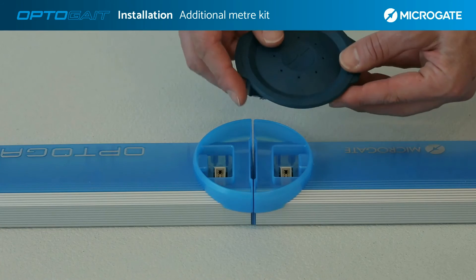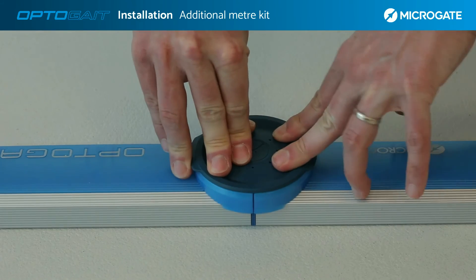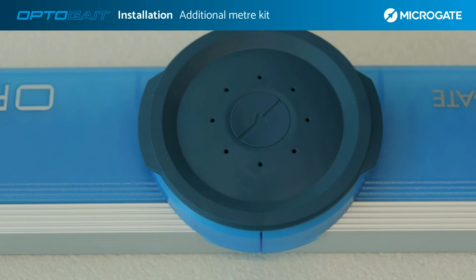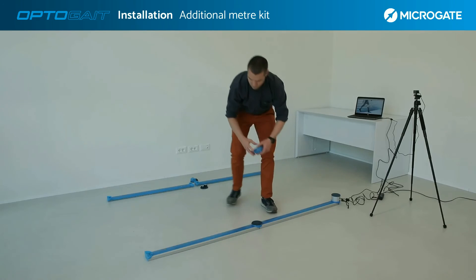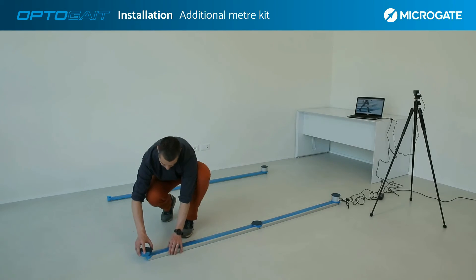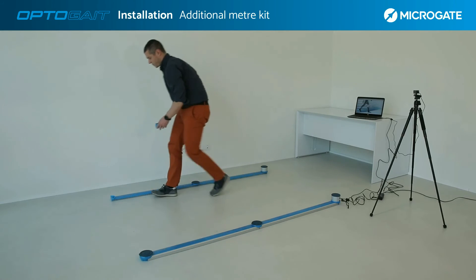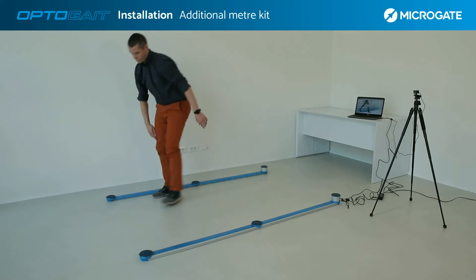Use the dedicated connectors to join the bars. Pay particular attention to the direction of the logo, characterized by an arrow that must be placed in the opposite direction to the LEDs. With these simple steps it is possible to install an additional meter, or dozens of meters, in just a few minutes. After the end caps are installed at the end of the line, switch on the system again.